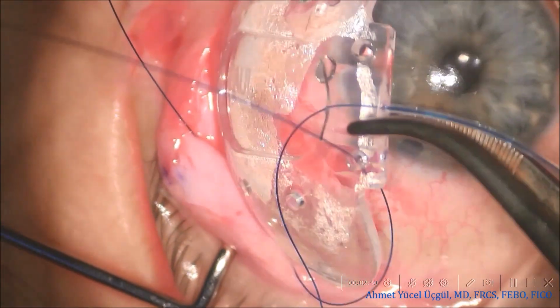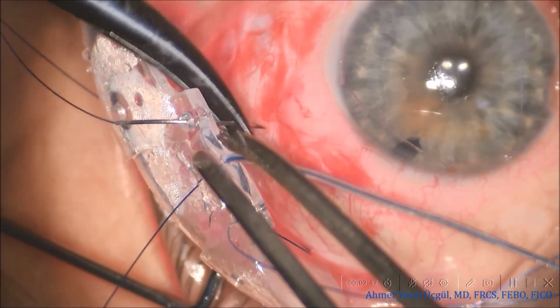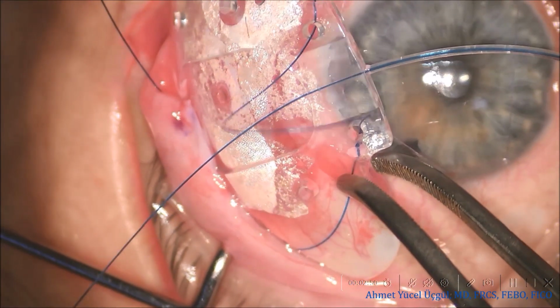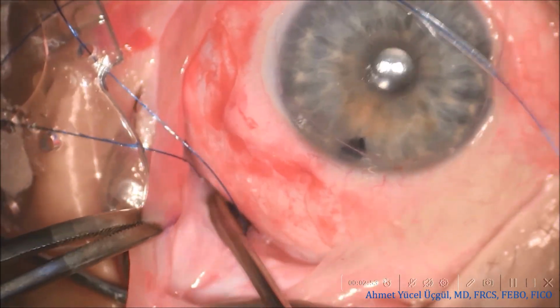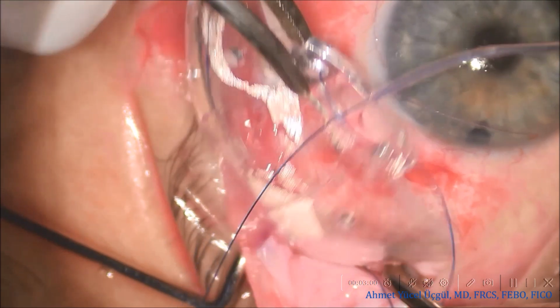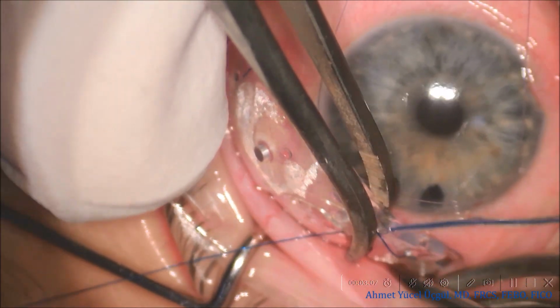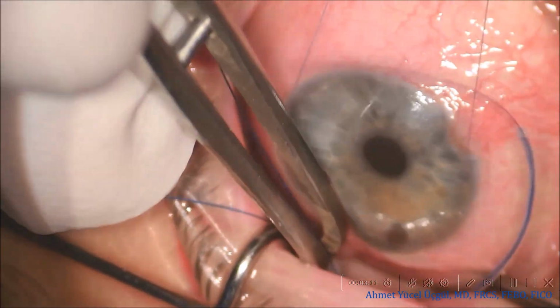The 6-0 Prolene fixation suture is then passed through the plate holes in a horizontal mattress fashion. Before tying the suture, I use a muscle hook to gently elevate the superior rectus and first position one edge of the plate beneath it. I then lift the lateral rectus and guide the opposite edge of the plate under that muscle as well. This maneuver is very important for long-term implant stability.